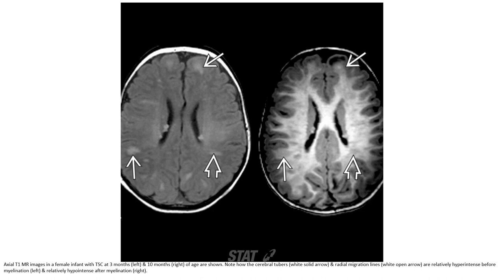T1 MRI images in a female infant with tuberous sclerosis at 3 months on the left and 10 months on the right. Note how the cerebral tubers and radial migration lines are relatively hypointense before myelination on the left, and relatively hyperintense after myelination on the right.